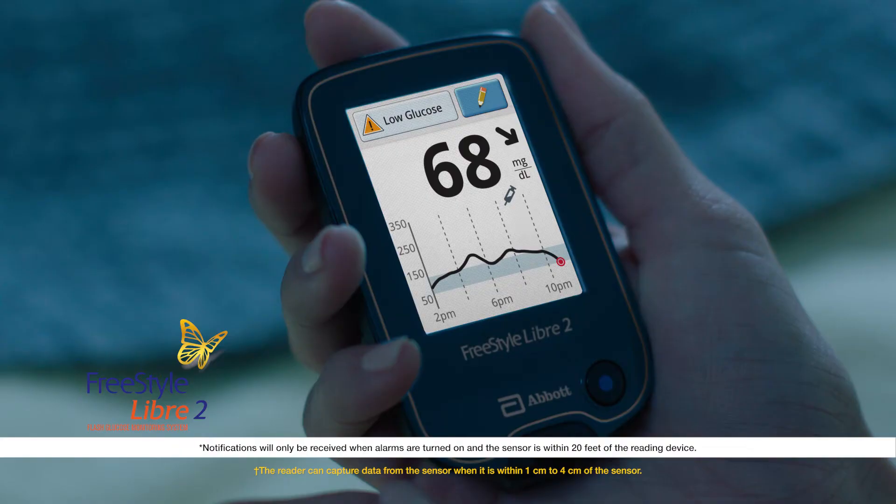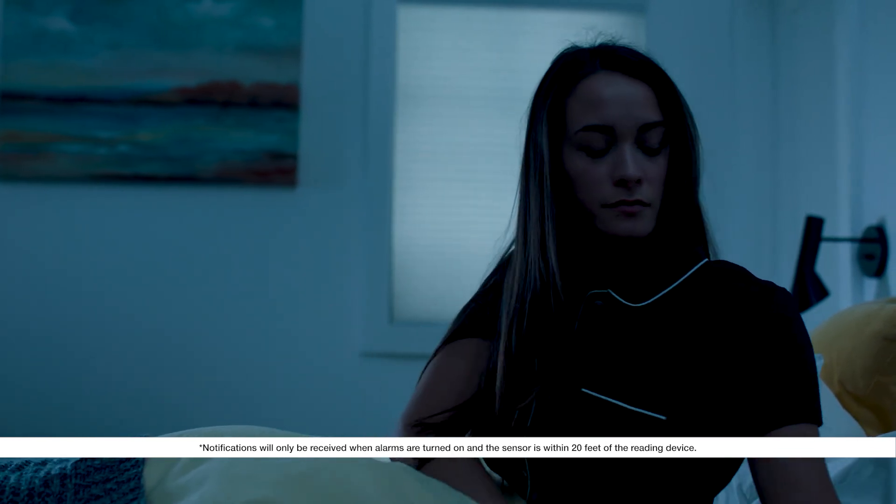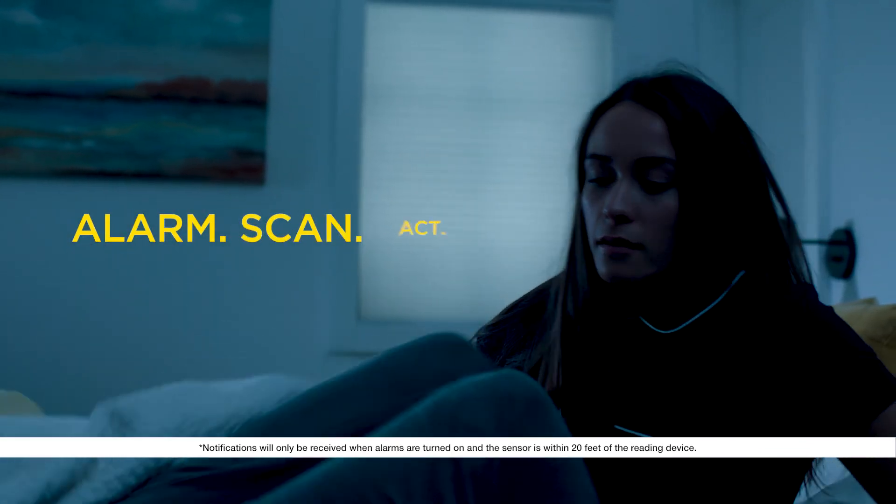The same process applies for setting and receiving high glucose alarms. For me, the Freestyle Libre 2 real-time alarms are very helpful. And the nice thing is, it's your choice to use them. Alarm, scan, act.